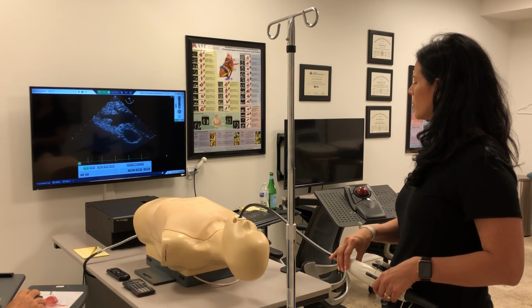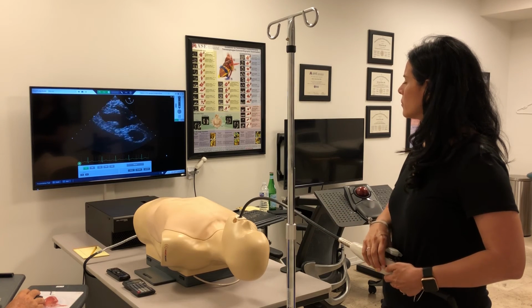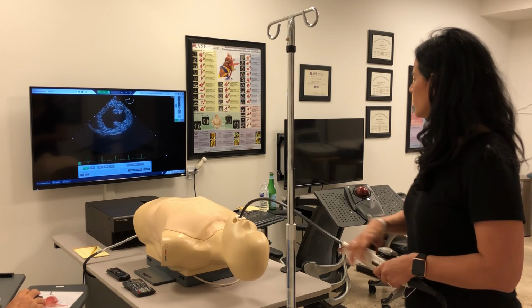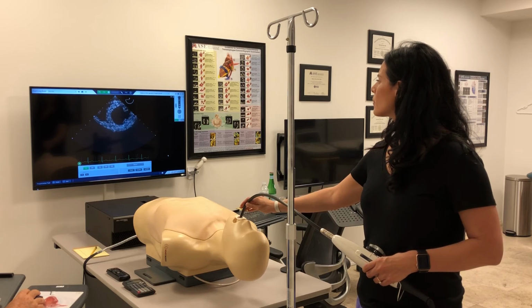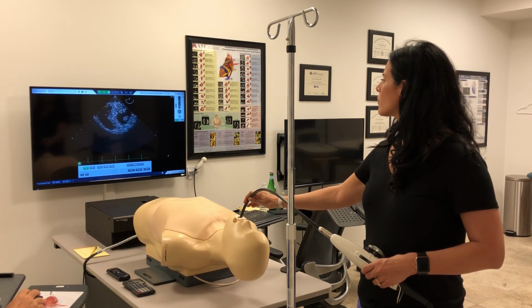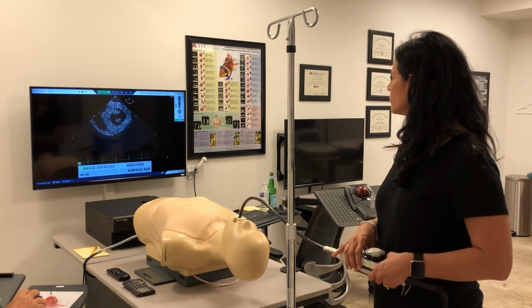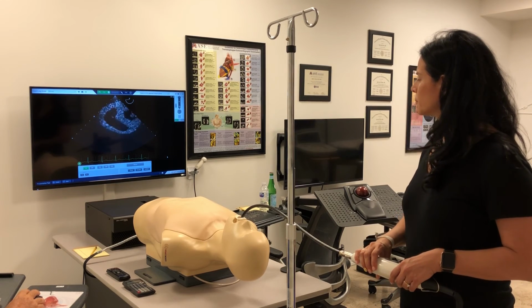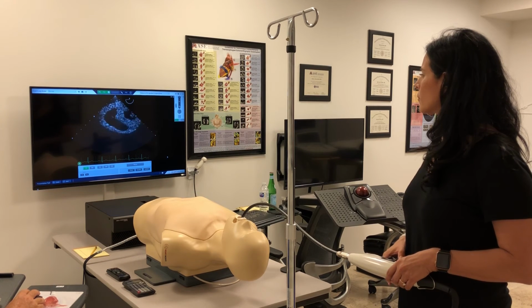Let's go to the next view, which is an interesting view. It's the transgastric RV basal view. So let's go back to the short axis mid papillary view by going to 0 degrees of omniplane. Good. And for this view, we kind of want to be high on the papillary muscles to where they almost start to turn into chordae a little bit. Yeah, I think that's nice. Now show yourself all of the RV, bring the RV to center screen with rotation of the probe. It'll be right rotation because the RV is on the right side of the patient. So right rotation is also called clockwise rotation.